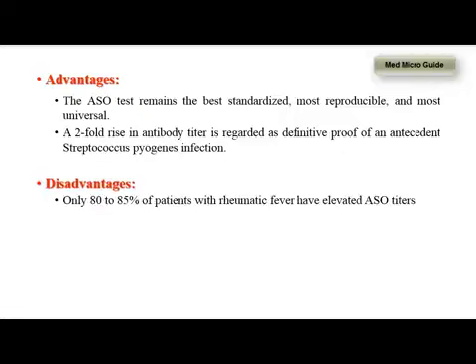The disadvantages of the test are that only 80 to 85% of the patients with acute rheumatic fever show elevated ASO titers. The rest, 15 to 20% of the cases, show false negative results. ASO titers will not be raised in skin infection.